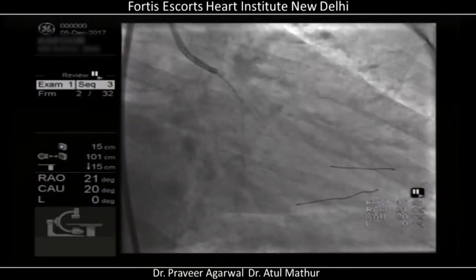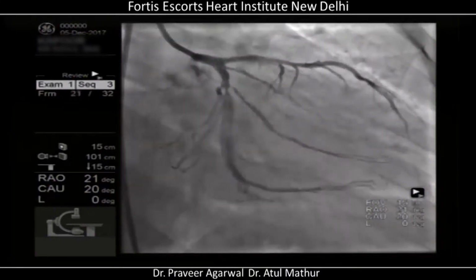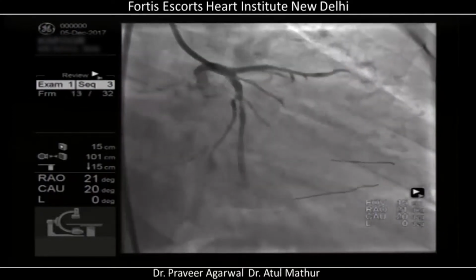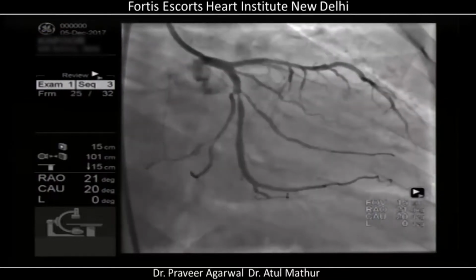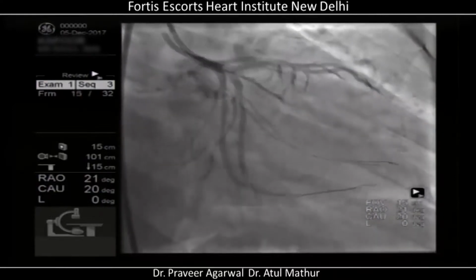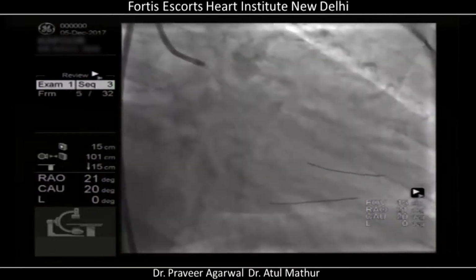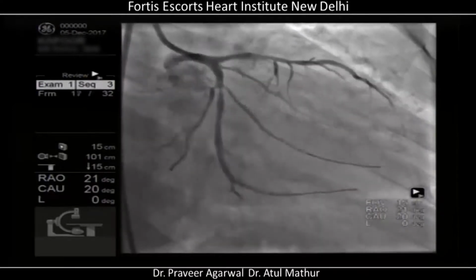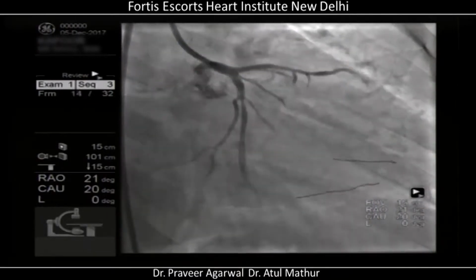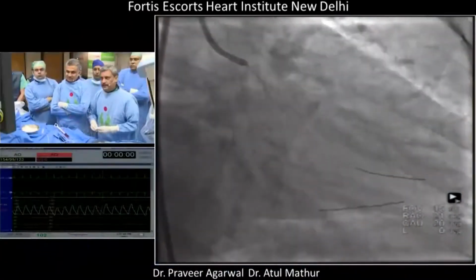And after this part is treated, then we will withdraw the wire from the side branch and go cannulate the main branch. One of the main branch earlier wires will be trapped outside the stent. So after this, we will go ahead and do a culotte deployment of a longer stent for the main branch, because we see it's a long plaque. Once you have done a culotte deployment, we have already pulled out the jailed wire. We will use that to again go and cross into the side branch and end up with a kissing balloon. So this is a second way of doing this case, which is a little more complex. It took me a longer time to describe.